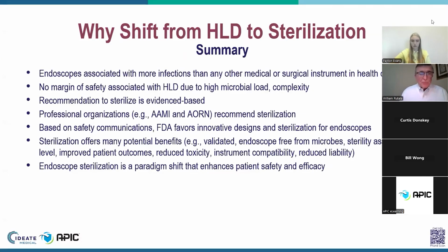We have a recommendation to sterilize, which is evidence-based. We have professional organizations, at least 7 or 8 that are recommending sterilization. And based on these safety communications from the FDA, we can be assured that the FDA favors innovative designs to include sterilization for endoscopes, and sterilization offers many potential benefits. To include, it's validated. The endoscopes are going to be free from microbes. There is a sterility assurance level that is achieved when, of course, the biological indicator is negative, and of course, it's cleared by the FDA.